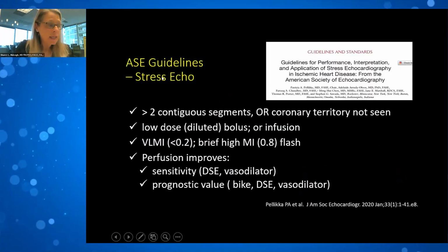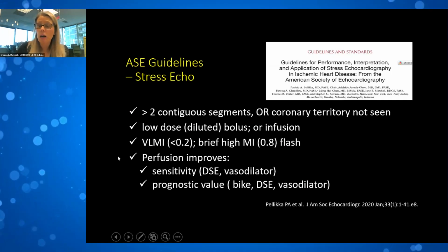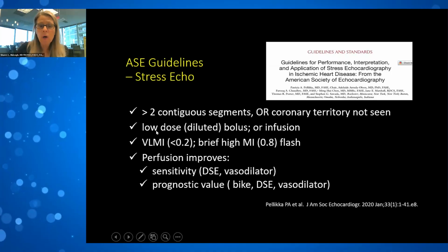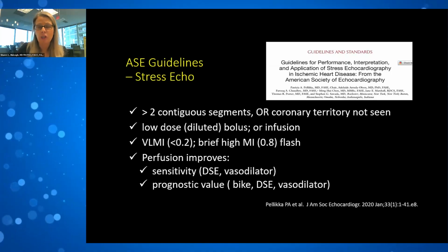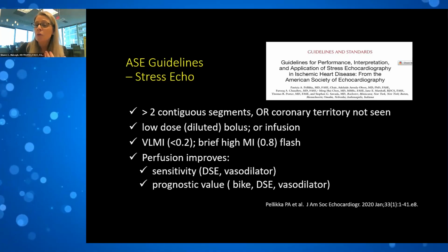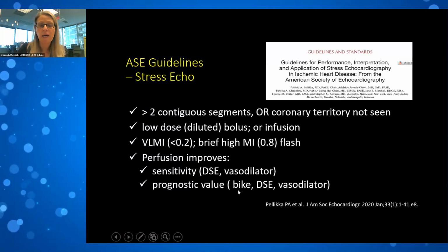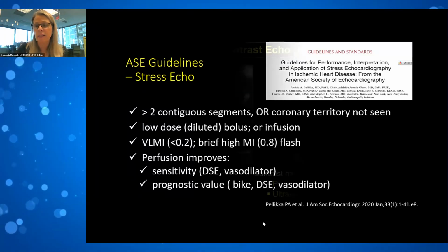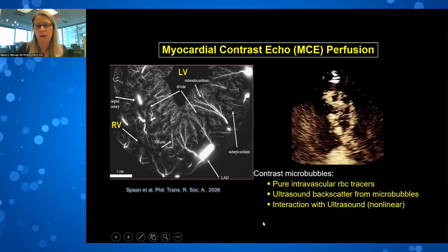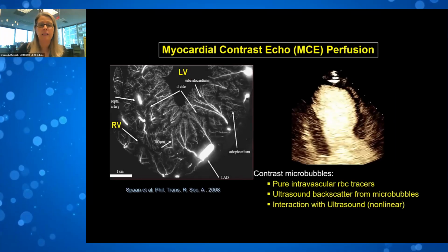In our stress echo guidelines, we clearly recommend the utilization of contrast for LVO as well as for perfusion. Now, I should say that this, and I forgot to mention at the beginning in my disclosures, that perfusion is an off-label application of contrast at the current time, but it is recommended in our guidelines, not only our stress echo guidelines, but also in our contrast echo guidelines, the most recent update having been published in 2018.